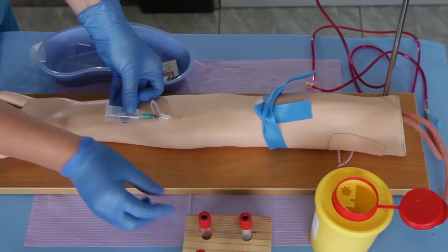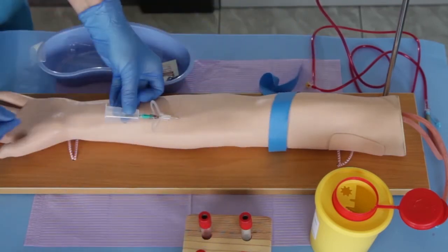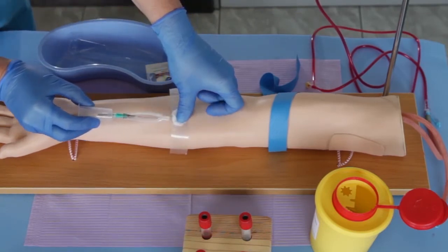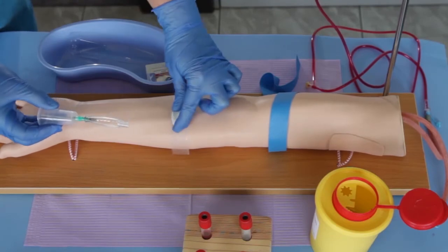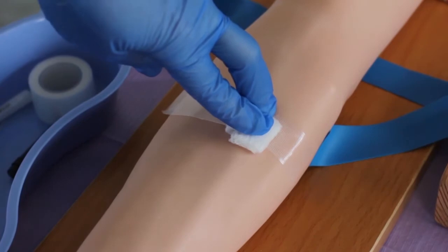Once sufficient blood has been collected, release the tourniquet before withdrawing the needle. Gently withdraw the needle and place a clean gauze pad or dry cotton wool ball with strapping on the site. Apply firm pressure to achieve hemostasis and avoid a hematoma.